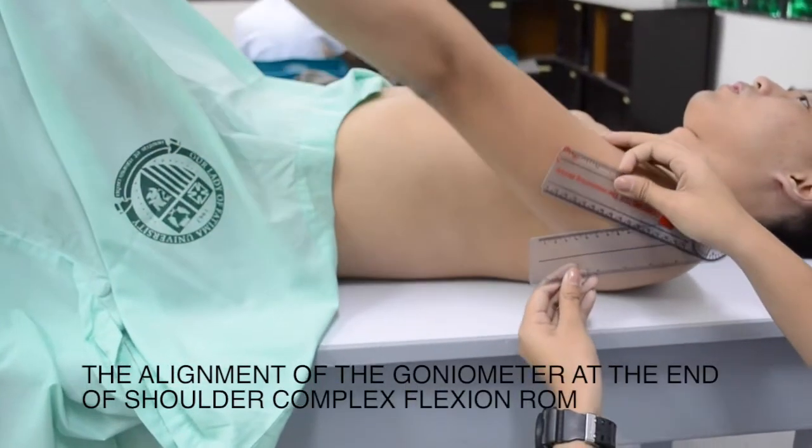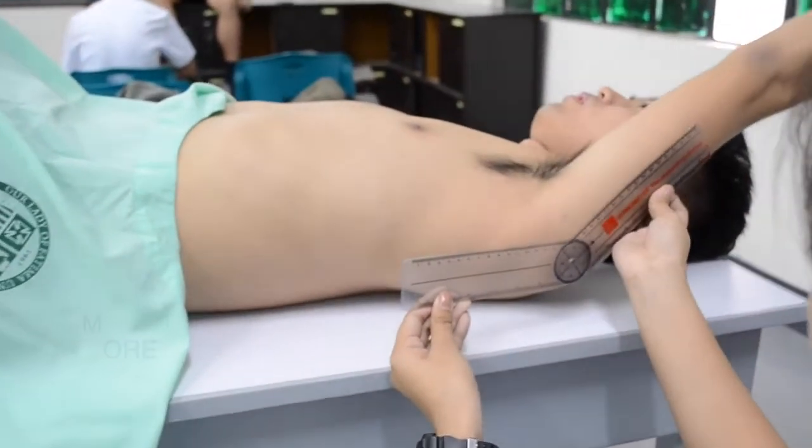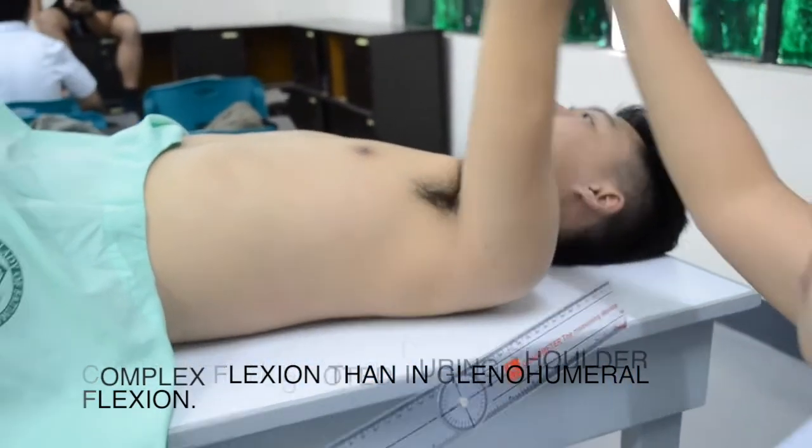The alignment of the goniometer at the end of the shoulder complex flexion ROM. More motion is noted during shoulder complex flexion than in glenohumeral flexion.